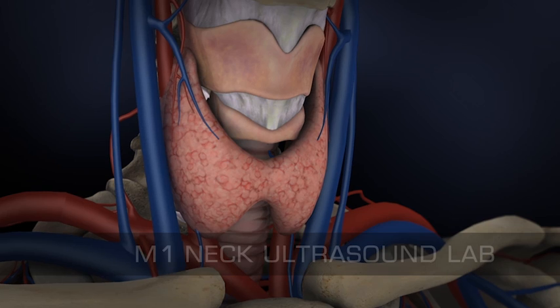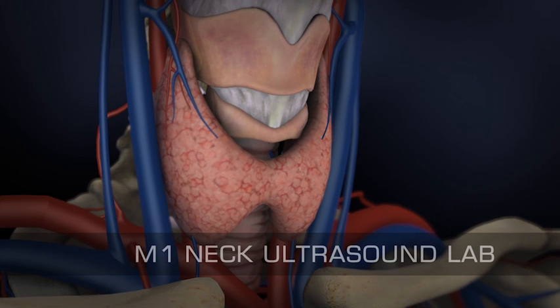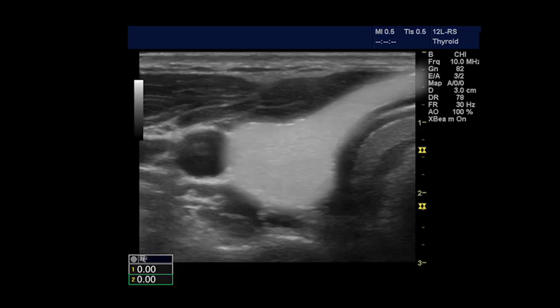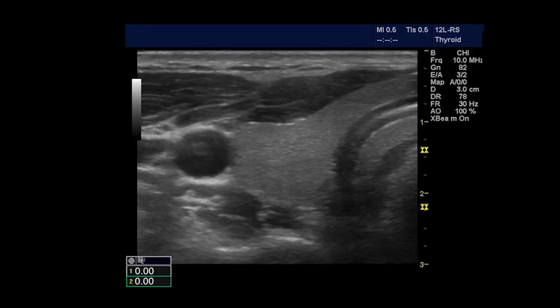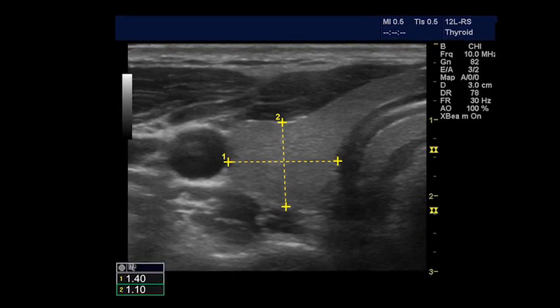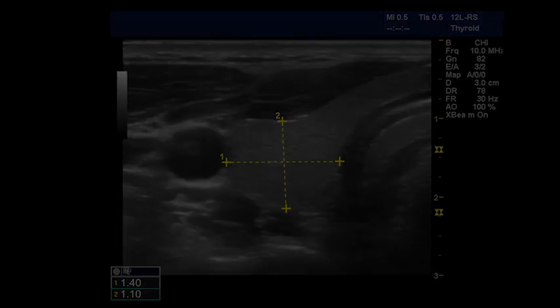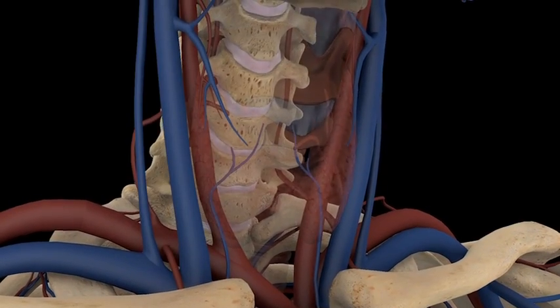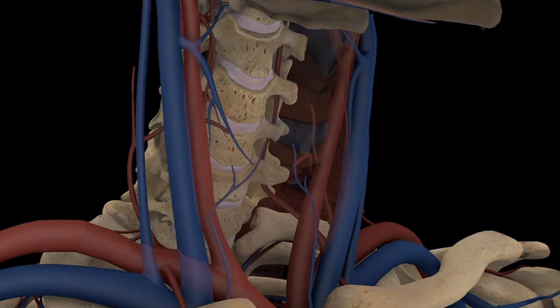The purpose of the M1 neck ultrasound lab is to demonstrate the anatomic relationships of the deep vessels, thyroid gland, and other adjacent structures of the neck. The image you are being asked to obtain for this lab assignment is a transverse view of the right lobe of the thyroid gland. The carotid arteries and jugular veins lie anterolaterally in the neck.